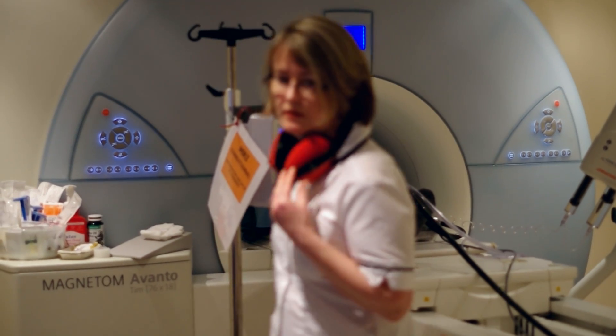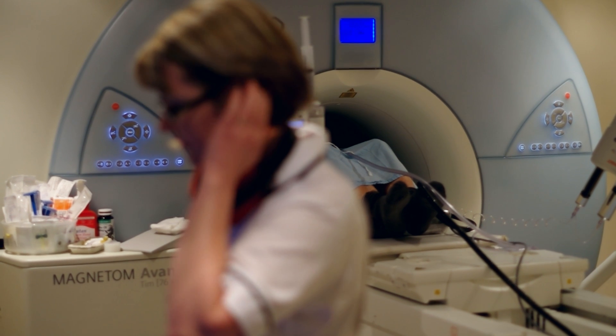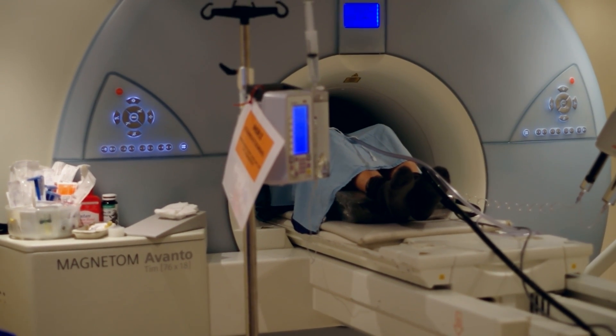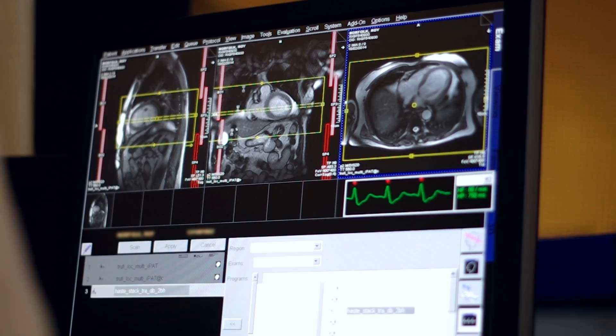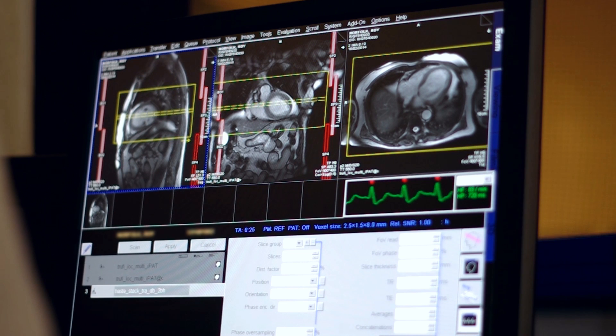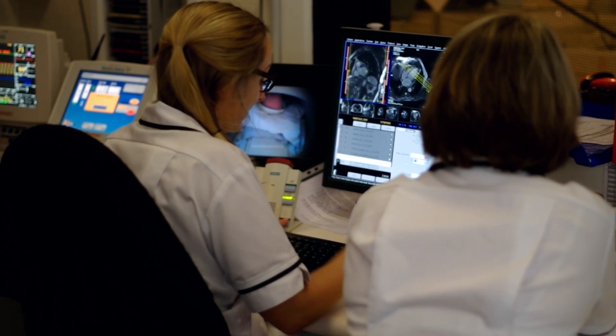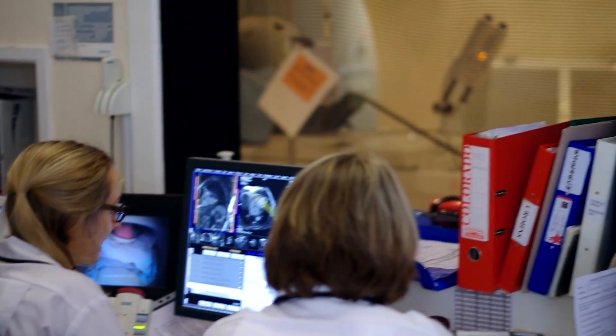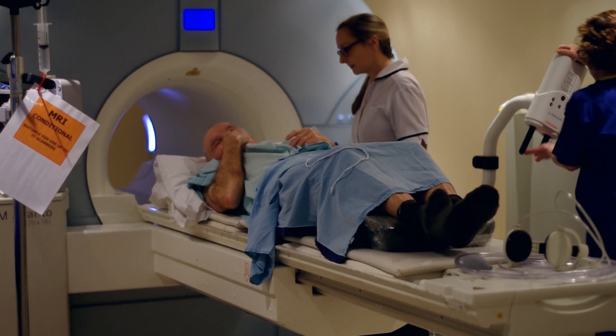We'll be in the scan room with you, so please tell us when you get any symptoms. Remember this is quite normal and shows that the medicine is working. We'll then take some more pictures. The medicine will be stopped and the effects will wear off after a few seconds.